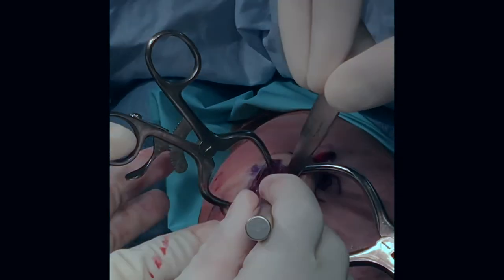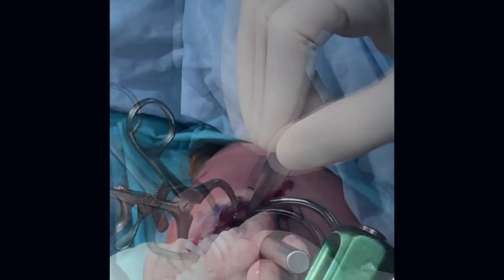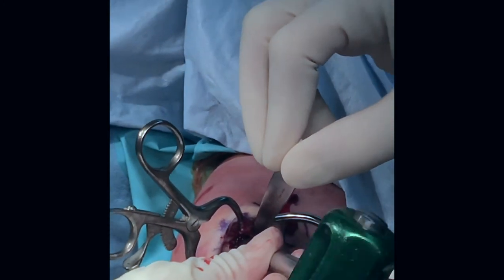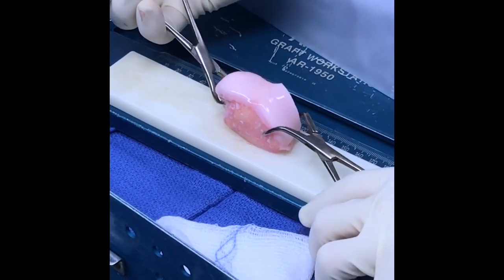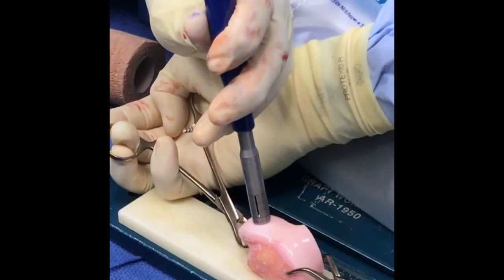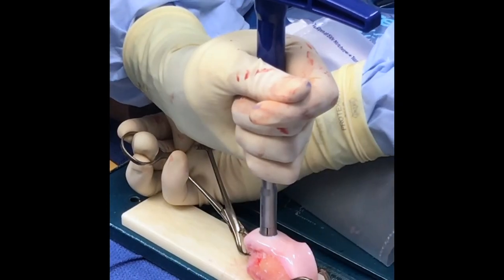A TAMP is used to ensure perpendicularity to the lesion and the appropriate depth. Next, a fresh osteochondral allograft is prepared from a donor.